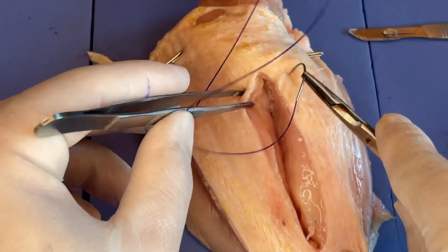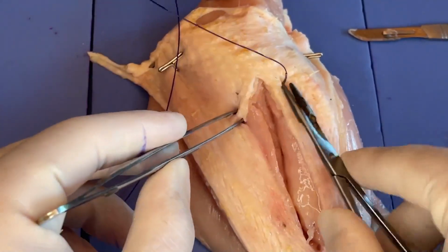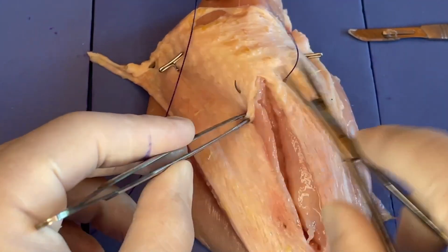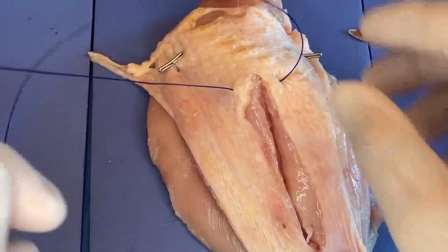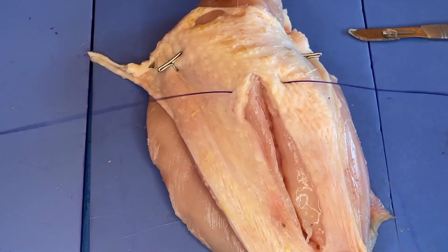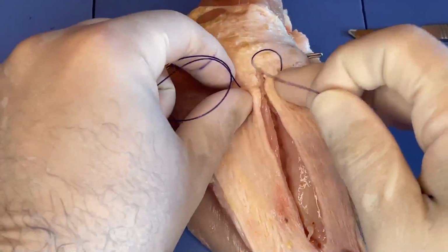So we're just going to do a couple of interrupteds here. We'll come down, see if we can go across in one here. This does leave quite sizable knots just because it's a thicker suture. Some folks do use a 0 PDS. I like the 1 for fascia.